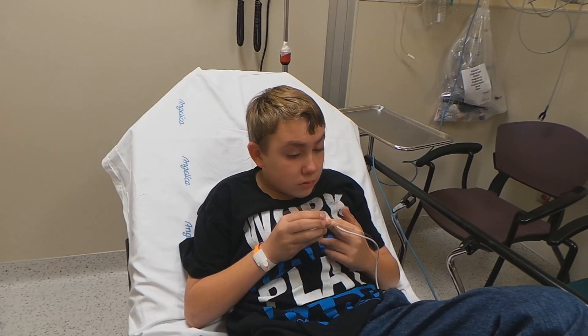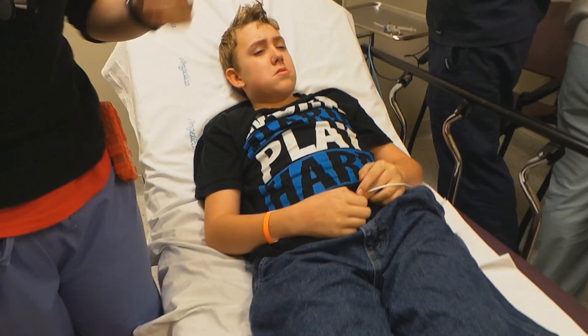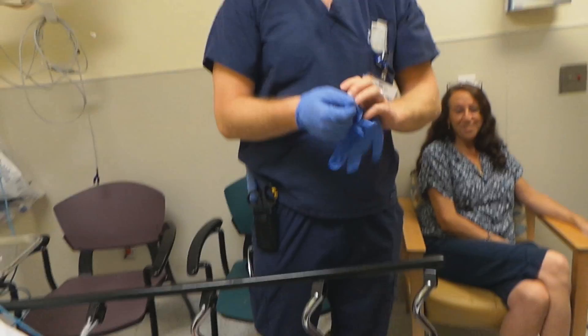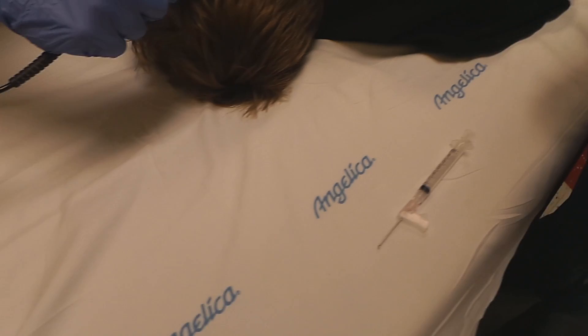I'm a little tired. Okay, that's okay. Go ahead and turn the lights on so we can have a little light here. All right, so who's going to be the operator? Arden is the doctor. This is our team here — you guys are going to end up on YouTube. I'm going to put you flat, okay? I'm going to have you look at me, I'll hold the light, and we're going to work on you. So you're going to try the 18-gauge piece of equipment? Just hold real still.